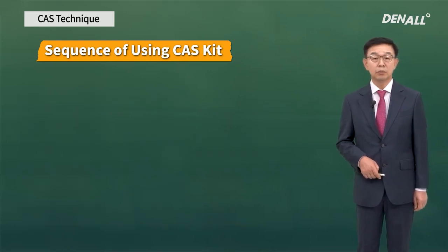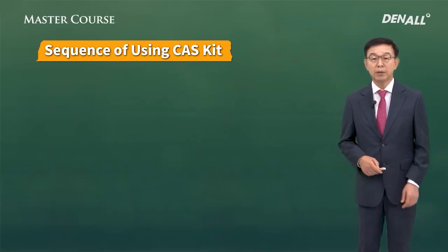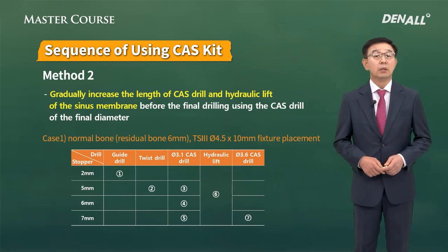Guided drill and twisted drilling is done. The width is gradually expanded. Once you achieve the desired width, you drill to the desired depths, check if the sinus floor is penetrated, do hydrolift, and then place the implant.